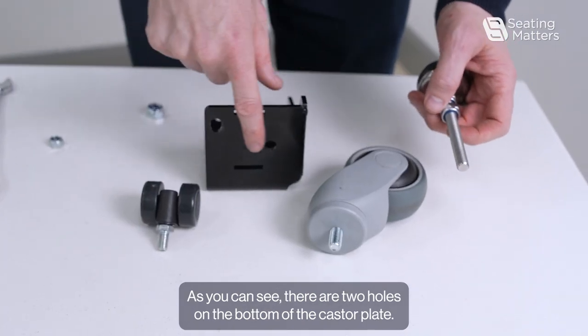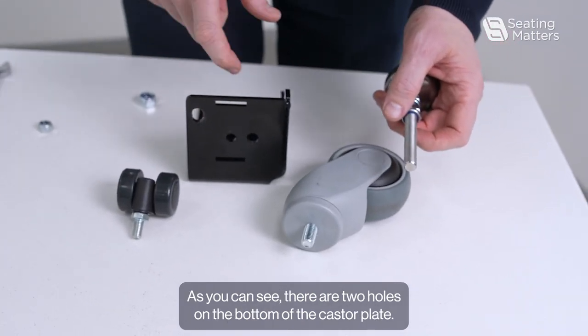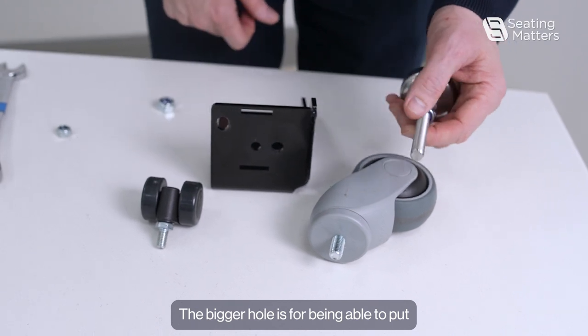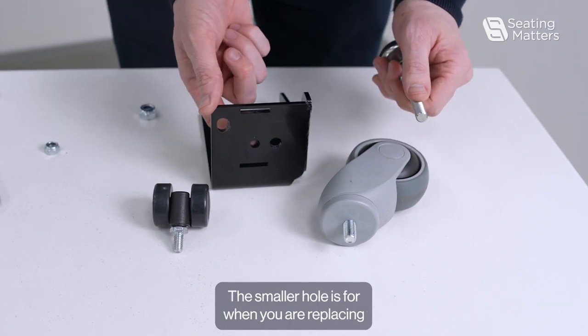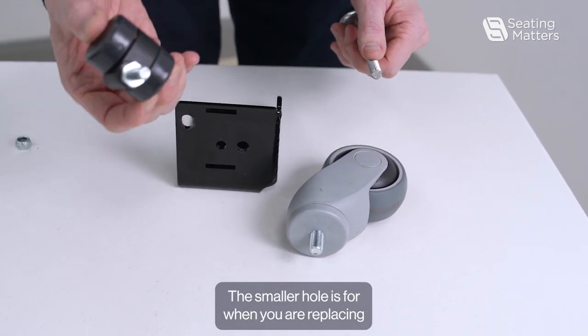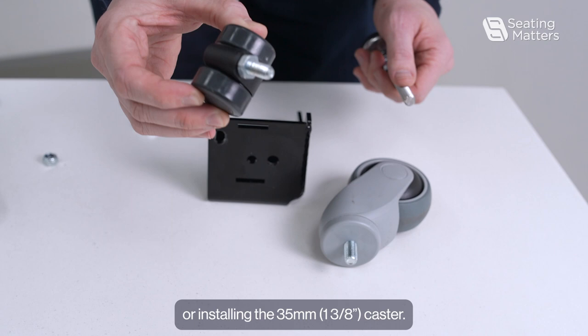As you can see, there are two holes on the bottom of the caster plate. The bigger hole is for fitting the 75mm caster and the stabilizing feet. The smaller hole is for when you're replacing or installing the 35mm caster.